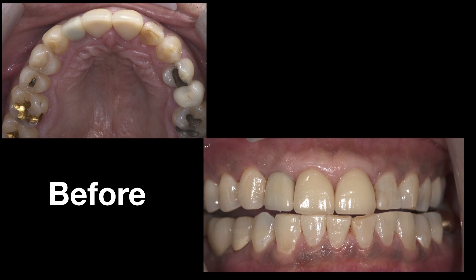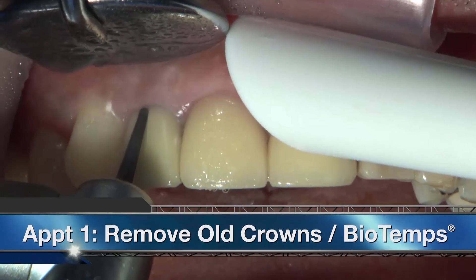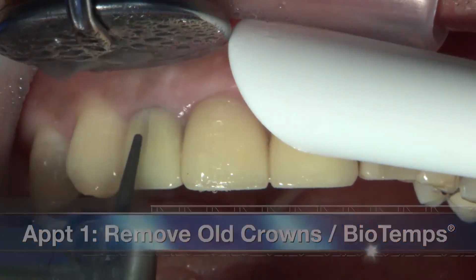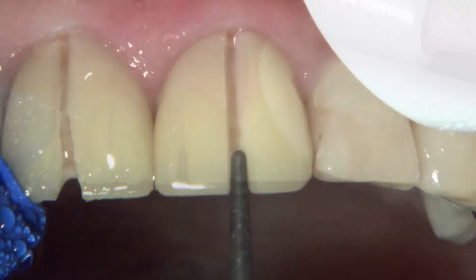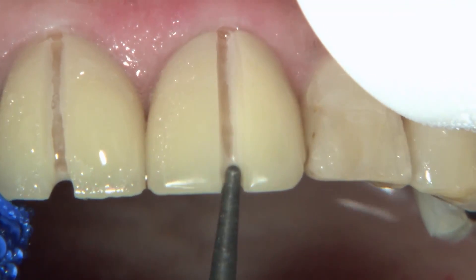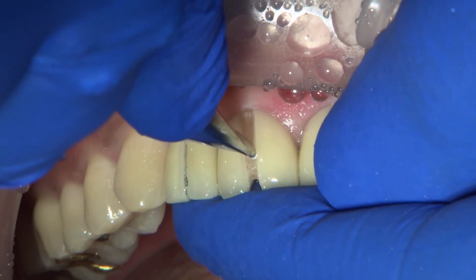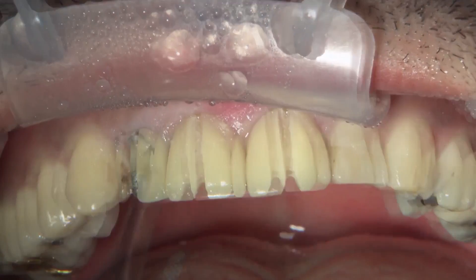Let's go over the case of the week. I want to present a case that was actually completed by Dr. Anna Maria Mirsan. She is one of our in-house dentists, and she's also a certified dental technician — an extremely talented individual. This patient presented for the need to have four anterior crowns replaced, teeth seven through ten.